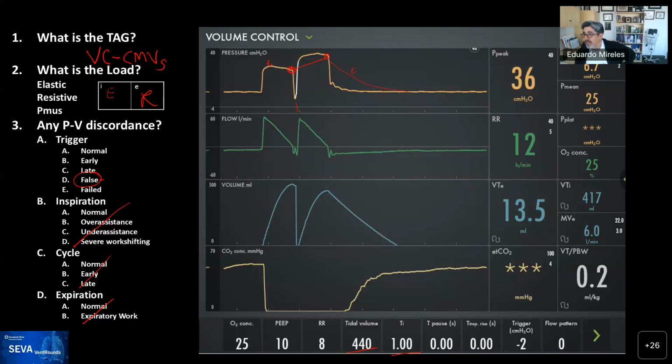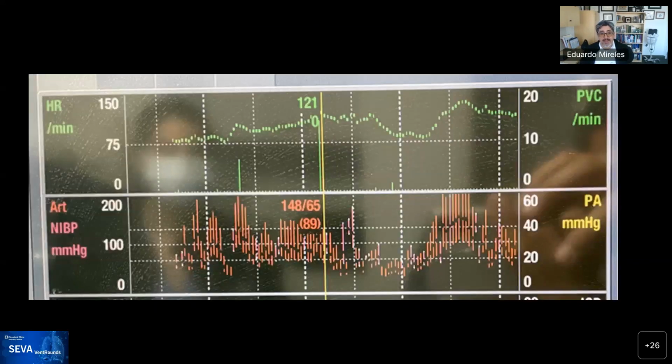The other question is from Ariel. That's a great question: would the level of PEEP make a difference? Actually, Ariel, that's a great point. The team at night increased the PEEP, and when we showed up, the PEEP was, I think, at 10 or 12. And when we had the scope in, we put PEEP on the patient, and you could see the diameter increase.